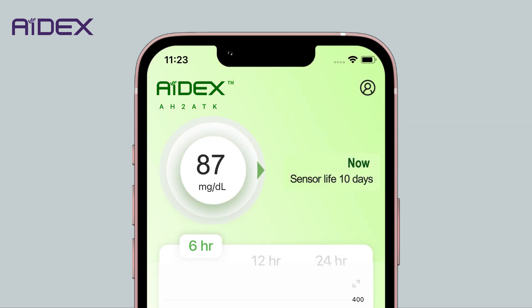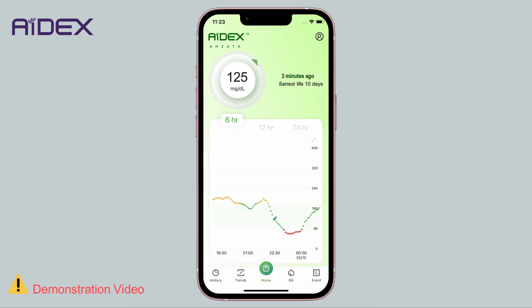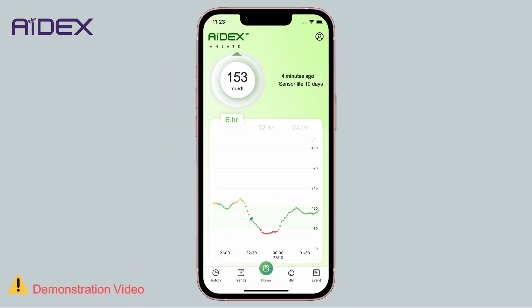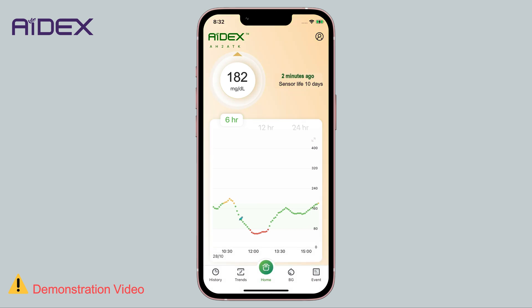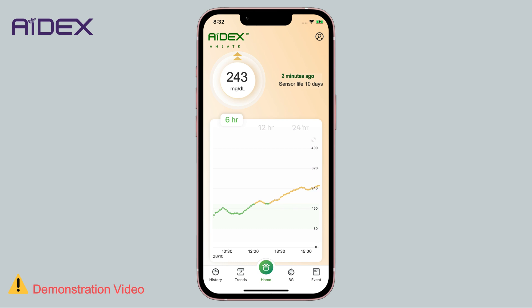Likewise, a 45-degree upward arrow means slowly rising, while a 90-degree upward arrow indicates rising. And a double upward arrow means glucose is rapidly rising.